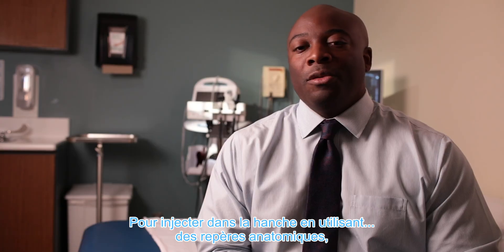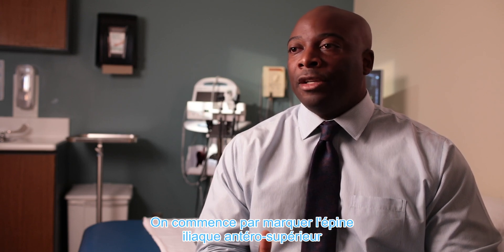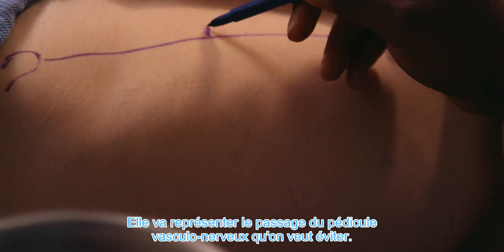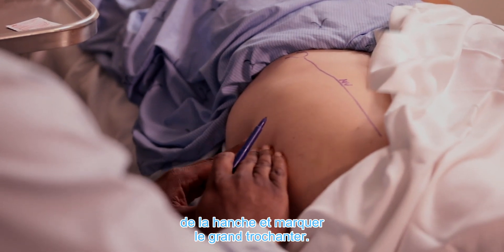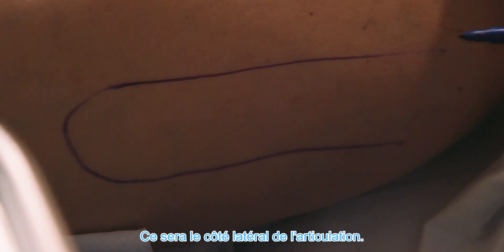In order to deliver the hip injection using anatomical landmarks and guidance, first it's good to mark out your anterior superior iliac spine and draw a line from that all the way down to the mid-thigh. That demarcates where the neurovascular structures are that you'd like to avoid. Then go lateral to the side of the hip and mark out the greater trochanter, which will essentially be the lateral portal to the hip joint.